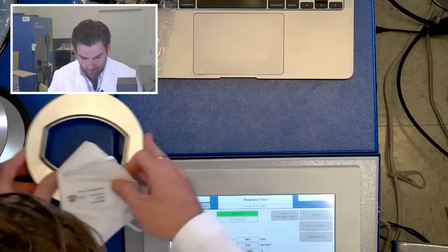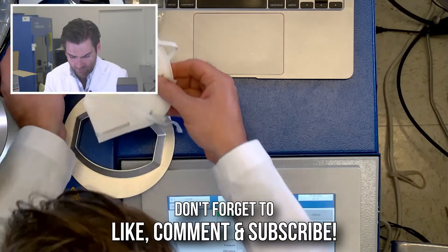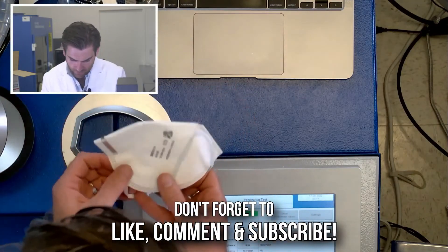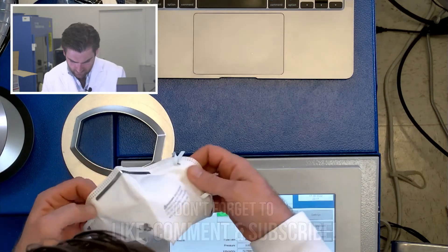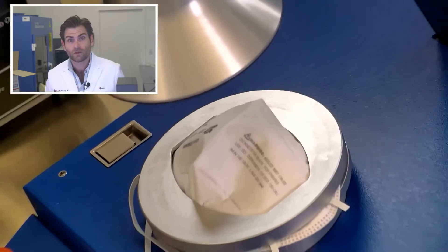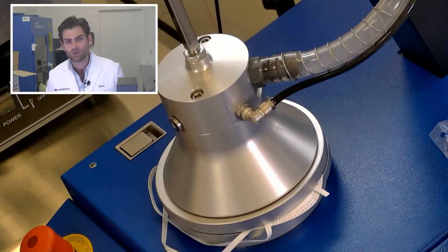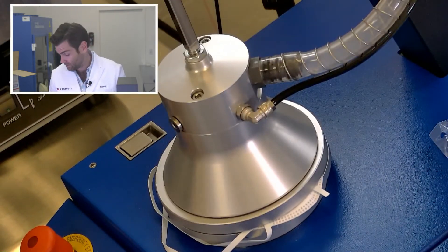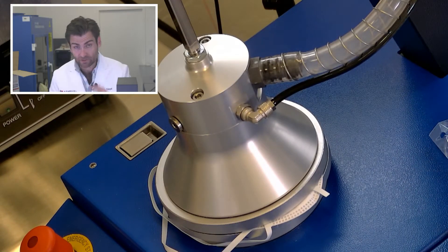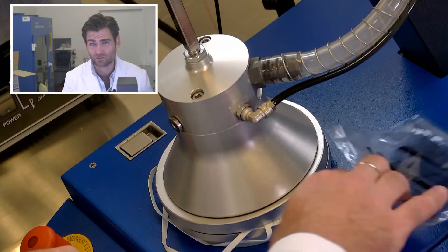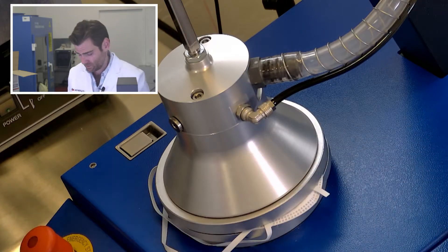Here we go. This is like the fifth 3M mask that we've had. This is the PFE machine, particulate filtration efficiency test. It looks like I'm running out of gas, because I am.